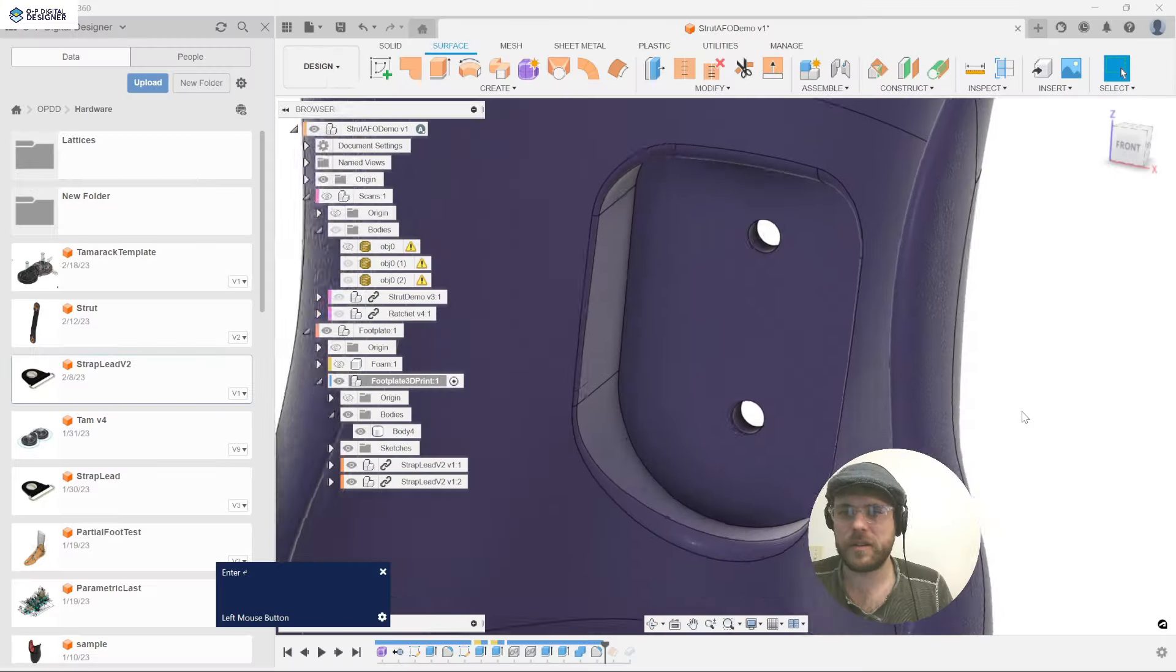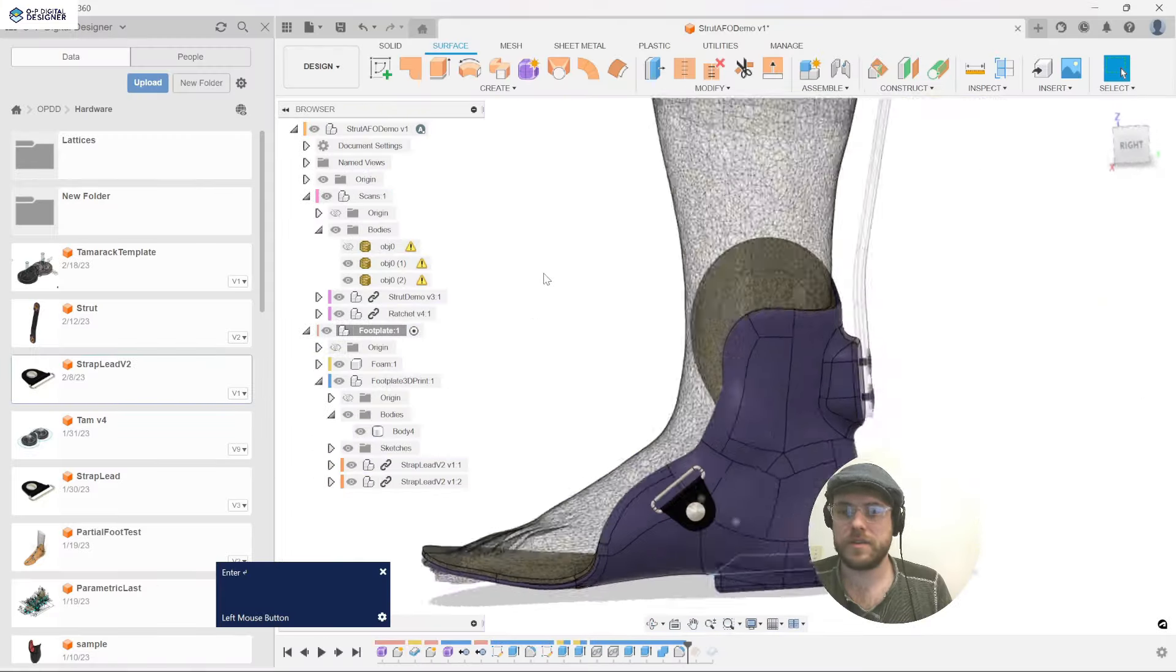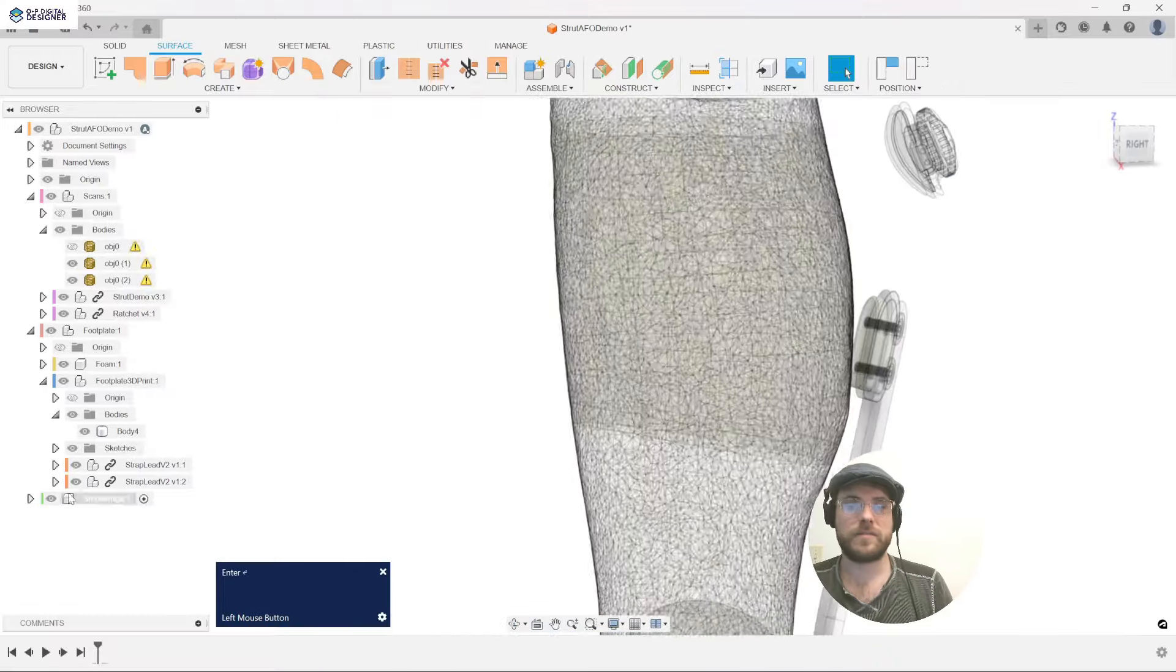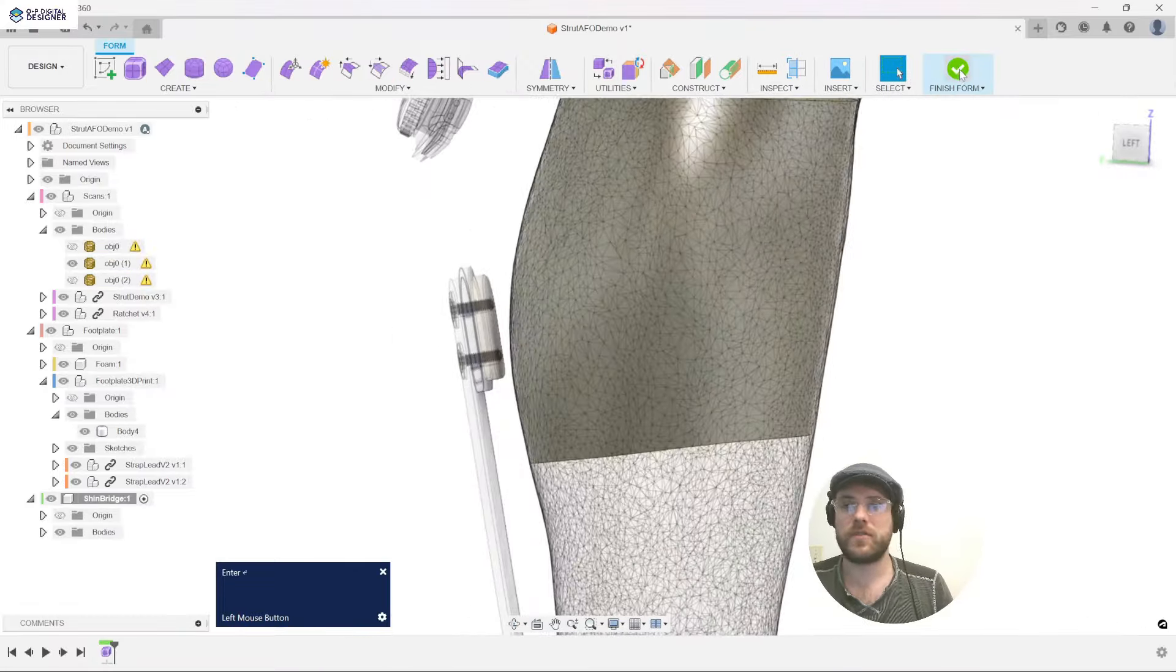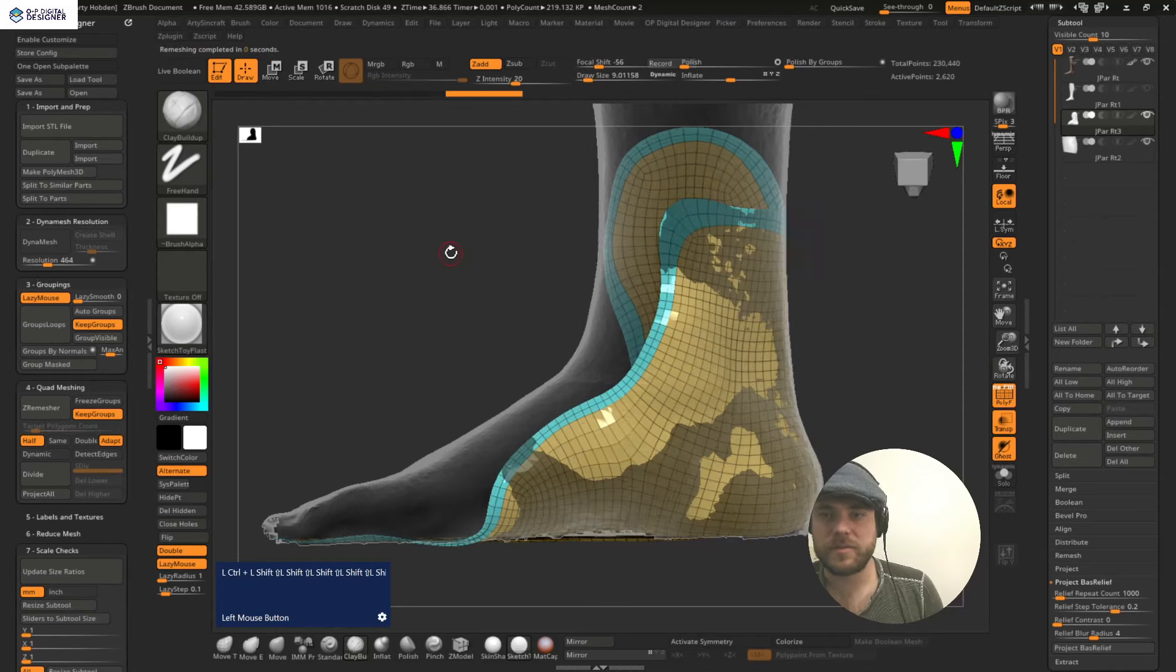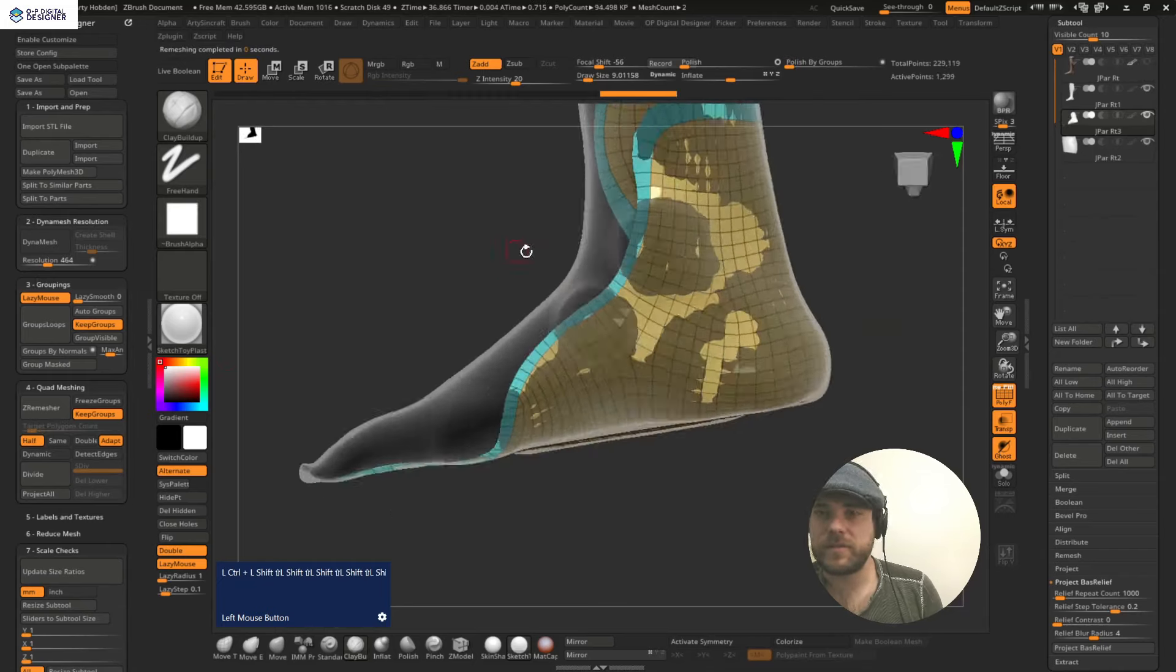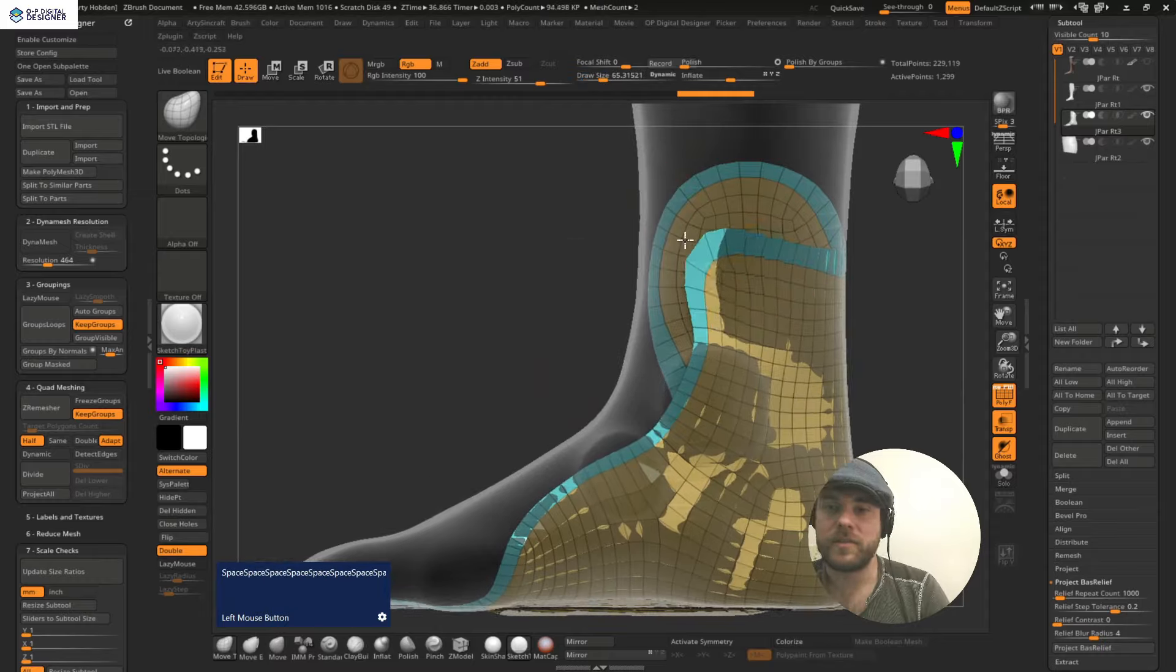This succinct ABCOP accredited course gives you everything you need to start creating patient fitting 3D prints from 3D scans using Autodesk's Fusion 360 and Maxon's ZBrush, one of the most powerful mesh editing tools in the software market today.